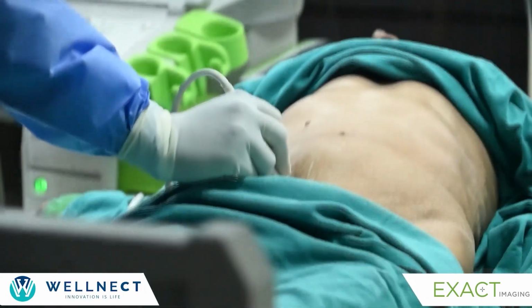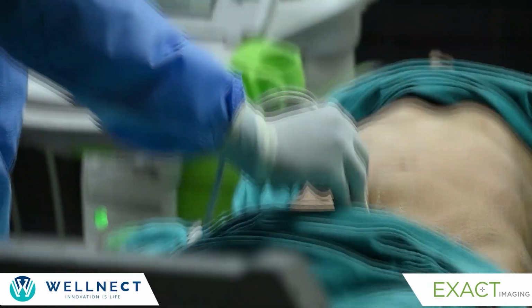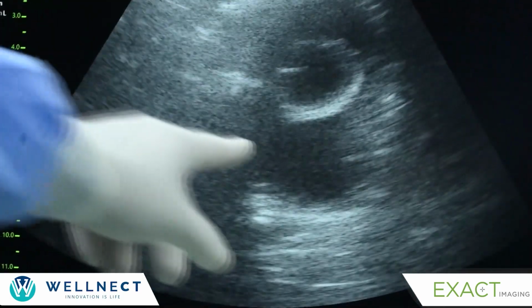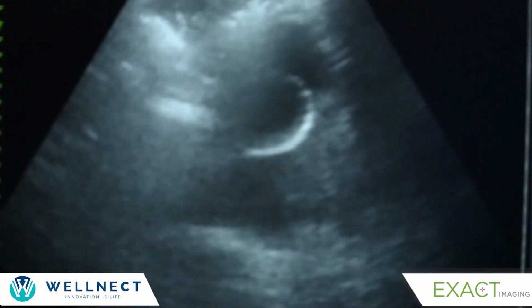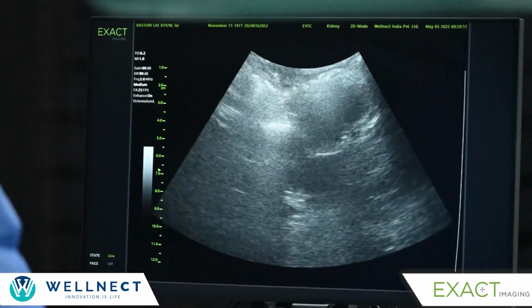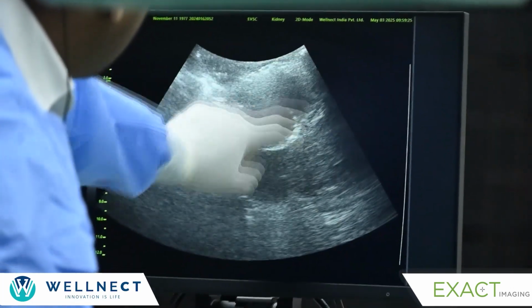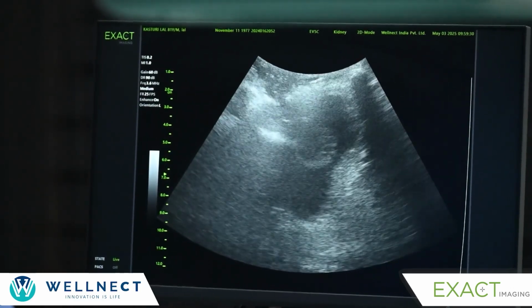Now if I were to see that in transverse section, can you appreciate this? So this is the bladder. This is the balloon, and this is the prostate. You see, there is some intravesical projection of the prostate, because of which the balloon is up. So this is your prostate, this is your bladder, and this is your balloon. Now we will shift to our transrectal ultrasound.